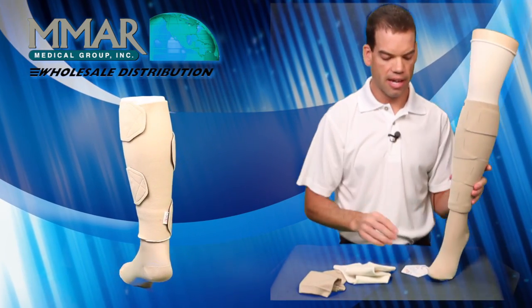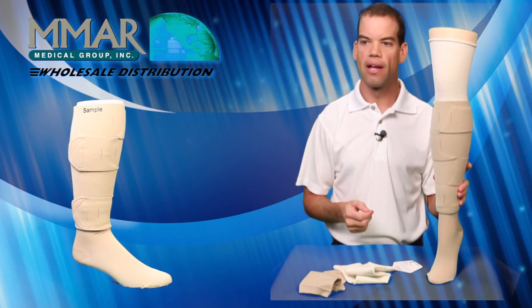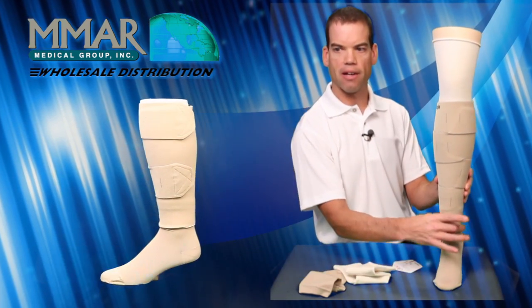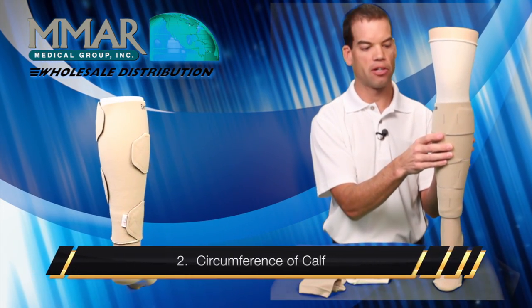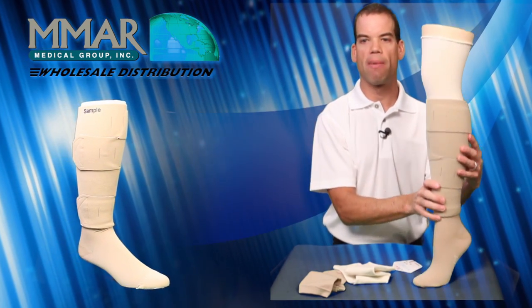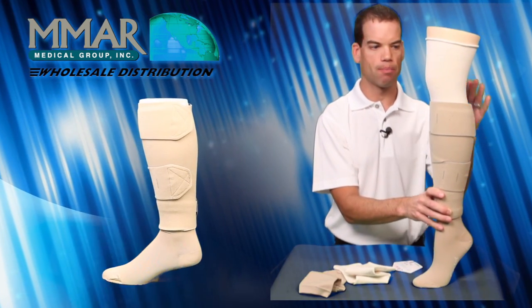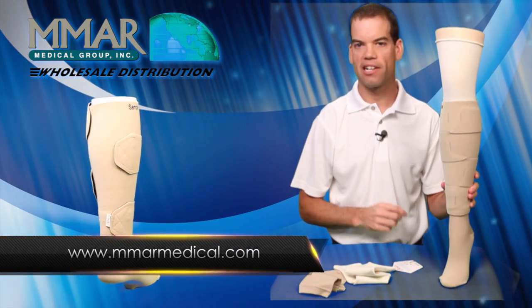The Juxtalite comes in 16 different sizes, which you can see on the website. To measure for the Juxtalite, you take the circumference of your ankle just a finger above the ankle bone, the circumference of your calf at the largest area, and the length from the back of the knee all the way down to the ground while standing flat with your heel down. You can then look at the chart on the website to find exactly which size Juxtalite you need.